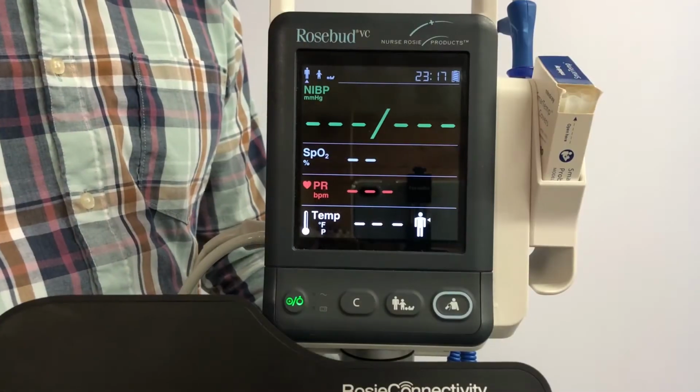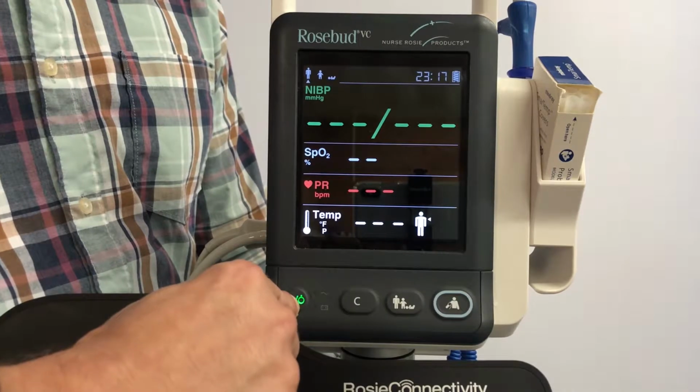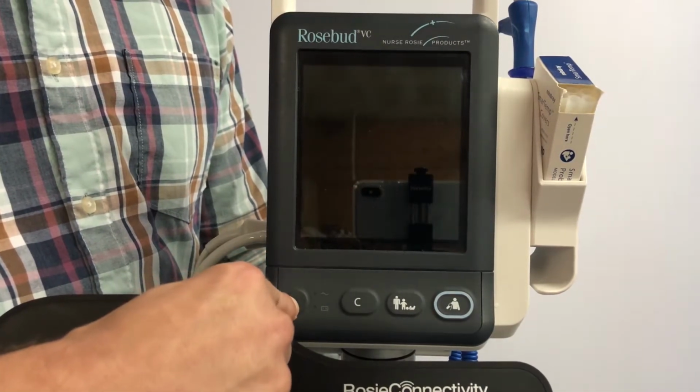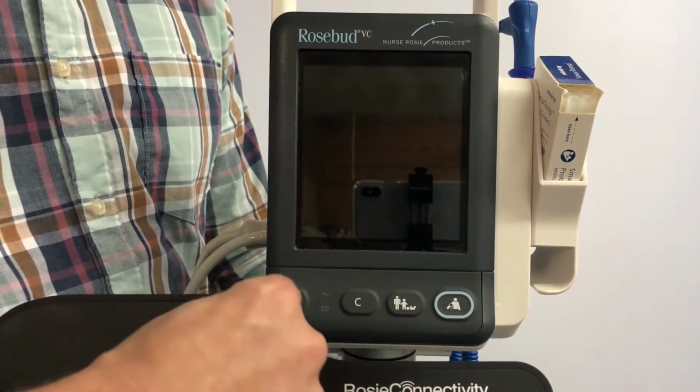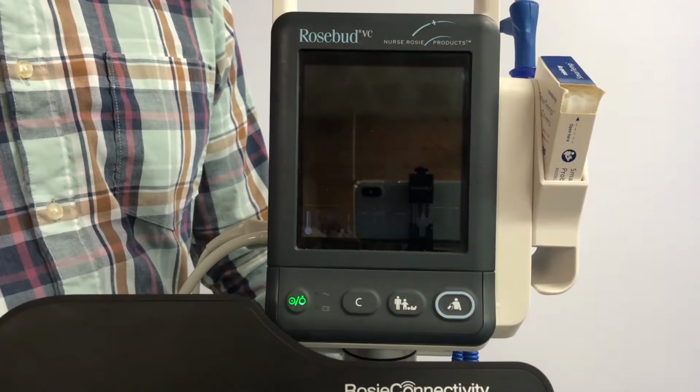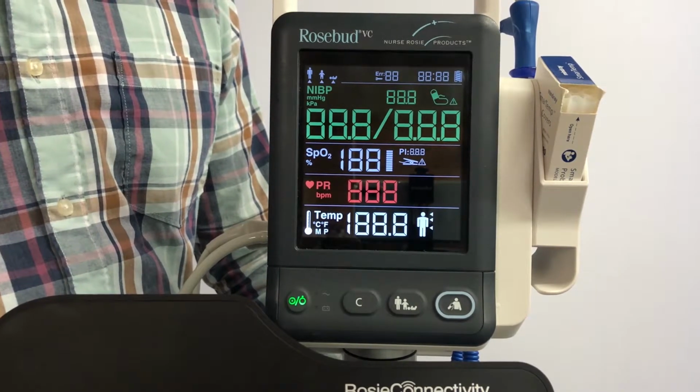To begin, ensure that the monitor is powered all the way down by pressing and holding the power button for 4 seconds. If the LED turns orange, the monitor is not powered all the way down. You want to ensure that the LED turns completely off. Next, press the power button once to turn the unit back on.